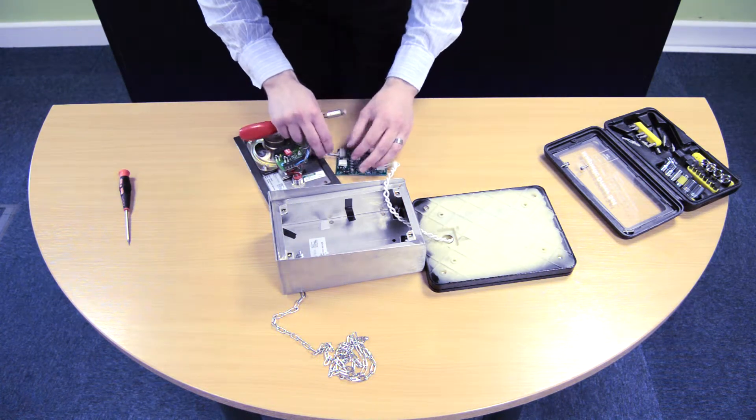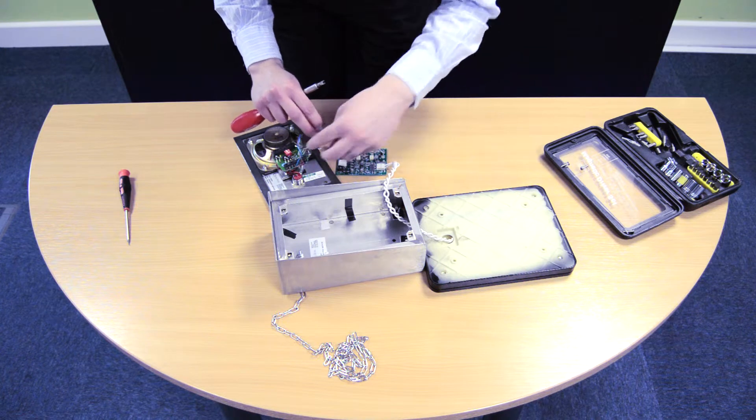Finally I'm going to wire in the power. This is coming from the intercom unit as well.